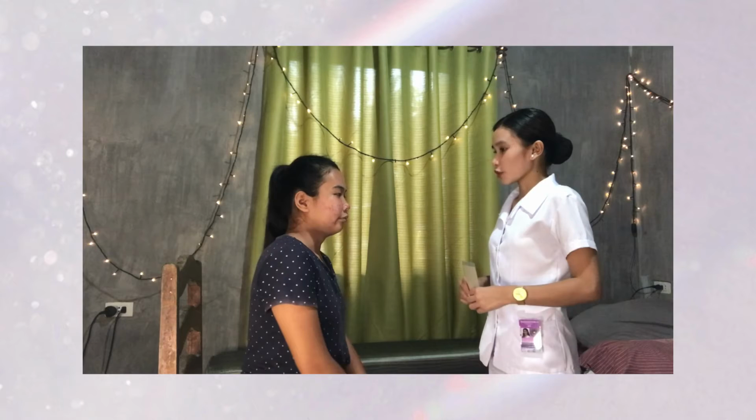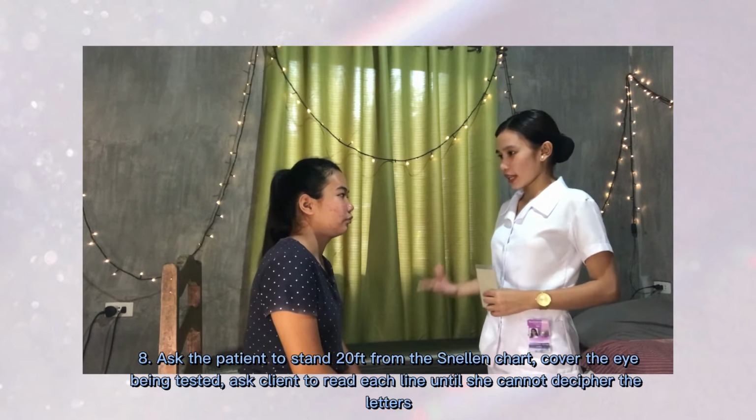Okay. Number 8. Have the client stand 20 feet or 6 meters from the Snellen or E-chart. Cover the eye being tested and ask the patient to read each line until she or he cannot decipher the letters or their directions. So now I'm going to ask you to stand up, Ma'am Ludi.